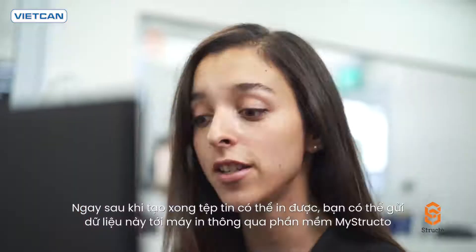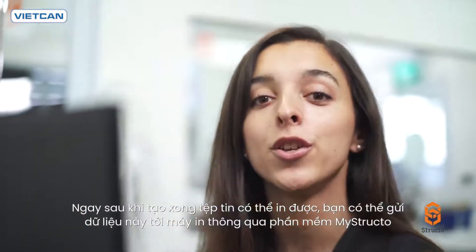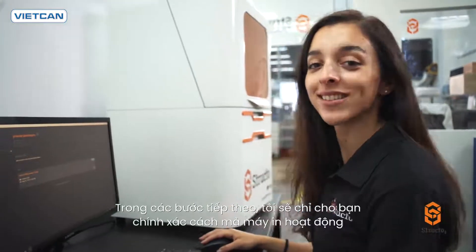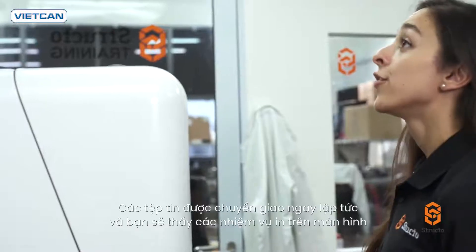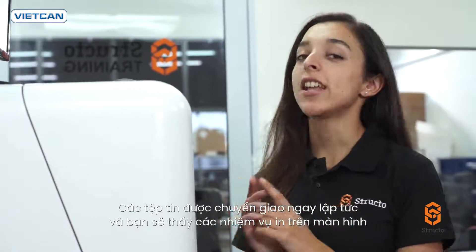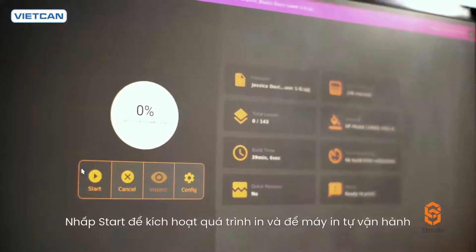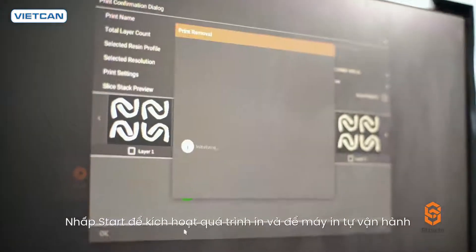Once the printable files are created, you can remotely send them to the printer using our MyStructo software. The files are transferred instantaneously and you'll be able to view the print jobs on the monitor. Click Start to activate the printing process and let the printer do all the work.